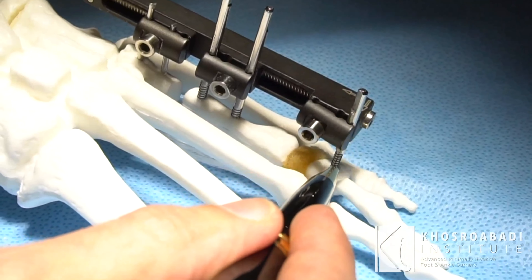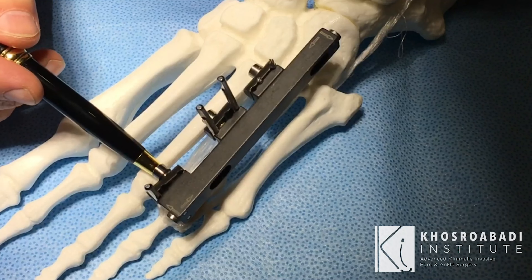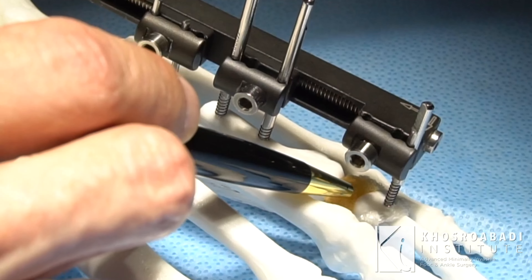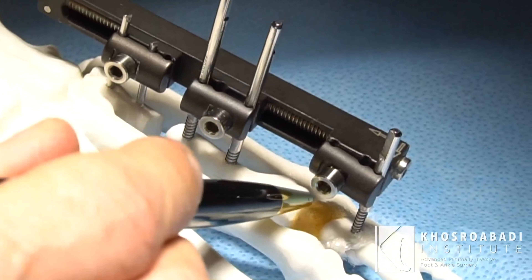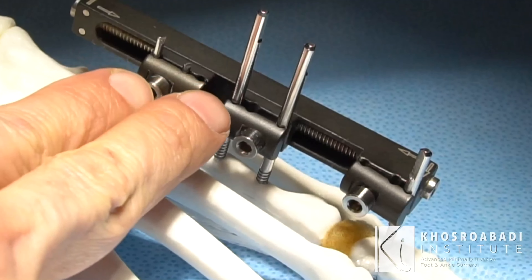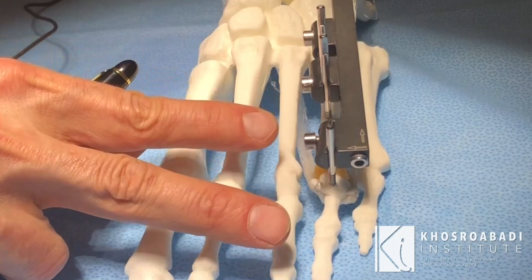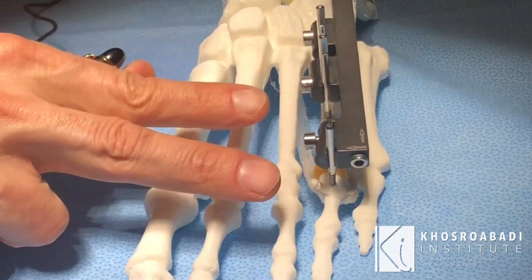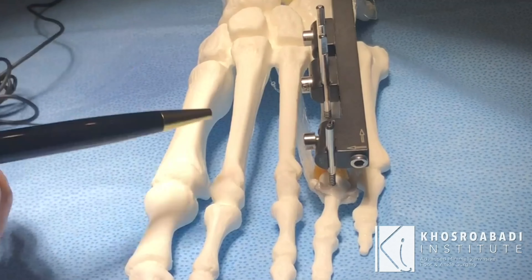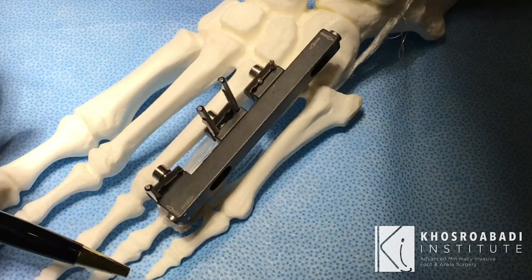This is the fourth toe. The third sandwich clamp and its pins go into the toe itself. These pins are responsible for keeping the joint integrity intact — meaning as we are lengthening, we are not compressing the joint. This clamp takes the toe with the segment of the metatarsal so the joint does not get disrupted or compressed, and the toe does not dislocate or rise up or down or to each side.